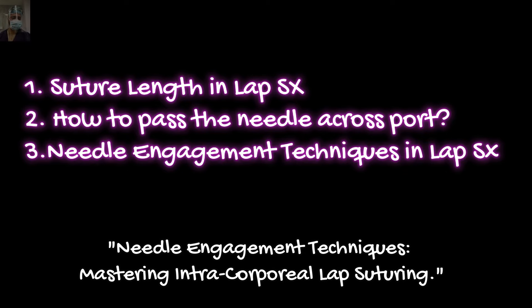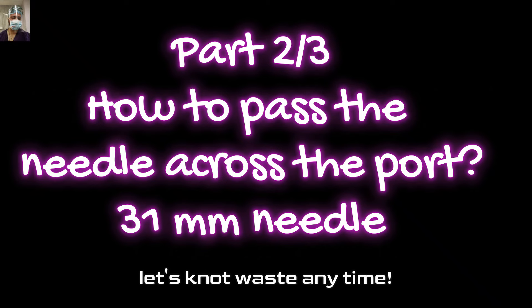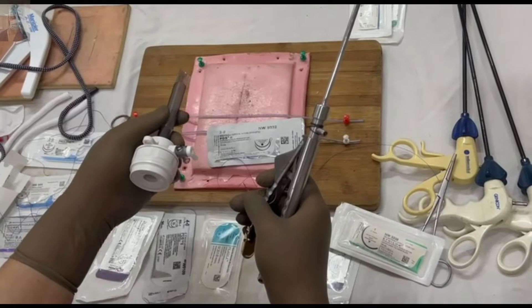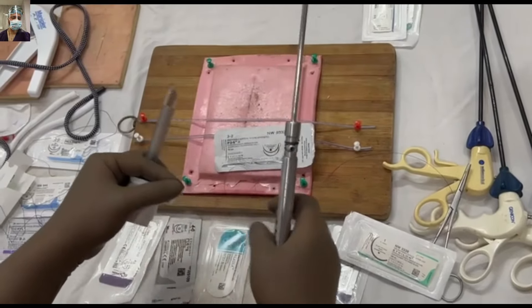So let's not waste any time. Let's start with the second part of this video — how to pass the needle across the port. First we will demonstrate how to pass a 31mm needle. This is a 3-0 PDS suture, and the needle length is 31mm.